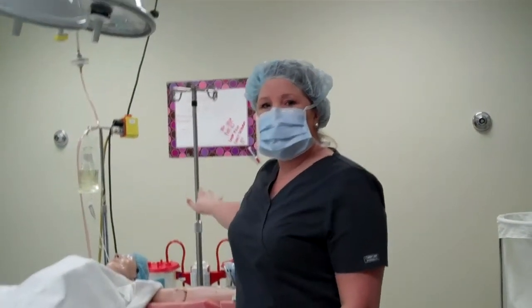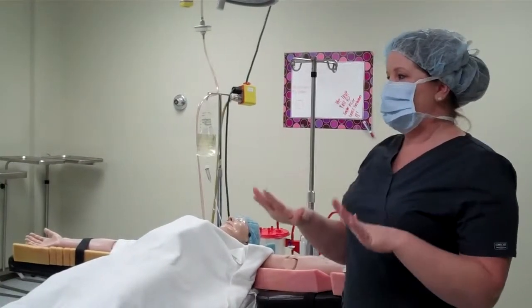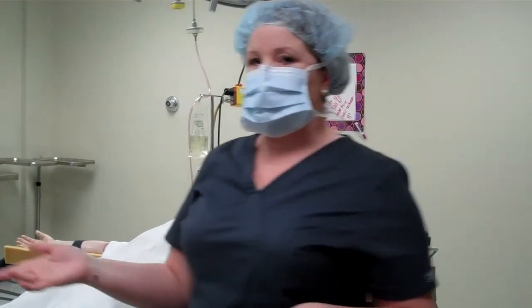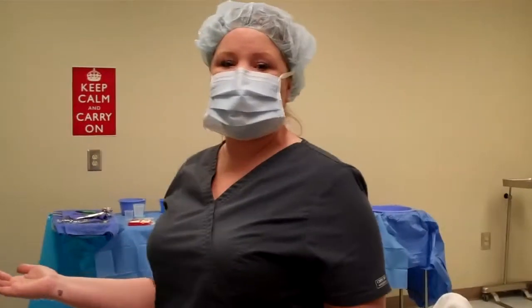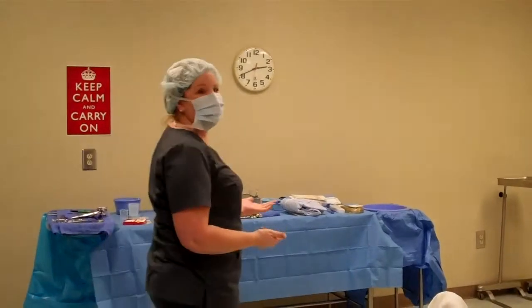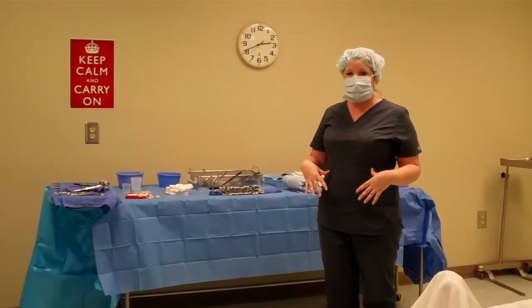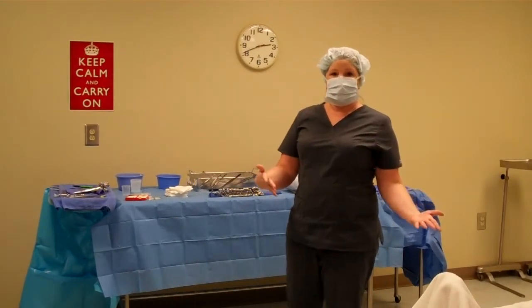You're mainly going to be up here with anesthesia at the head of the patient, okay? But I want to tell you to make sure that you stay away from anything that is blue, okay? So I'm going to walk over here, because when you first come in here with your patient and with anesthesia, there's going to be a surgical technologist over here working on the table. I don't have a gown and glove on right now, so it's fine for you to be around me.